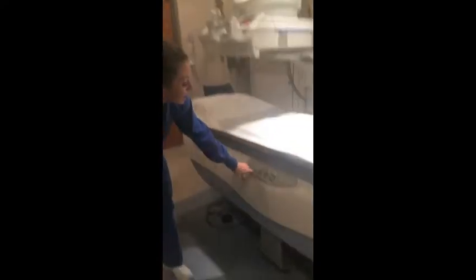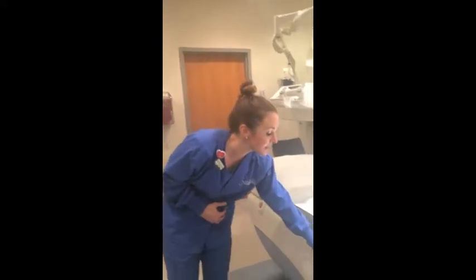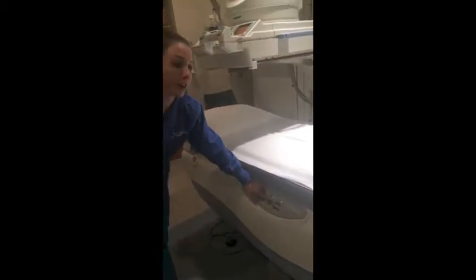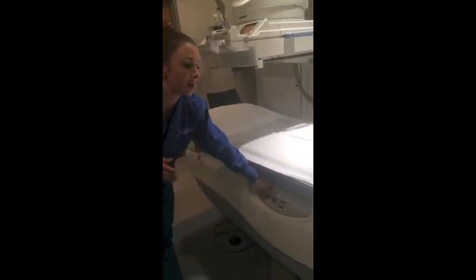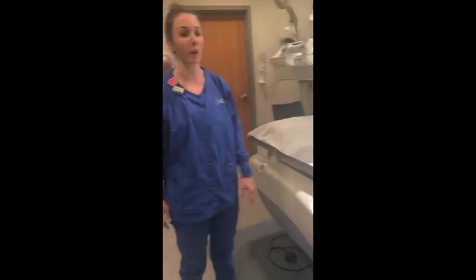Next, I want you to pay attention to the tabletop arrows. This is what's going to move the table down, up, left, and right. That's important when you are positioning the patient. So once you bring the stretcher in and have the patient move over, or if you and your coworkers move the patient over, you can move the table over. And then after the patient is positioned on the table and is safe, you can move the table so that it's directly under the fluoro.